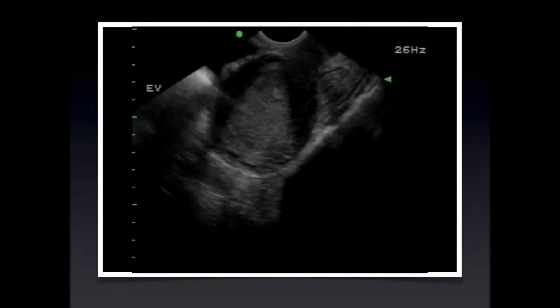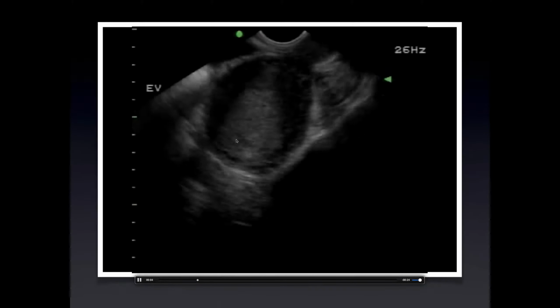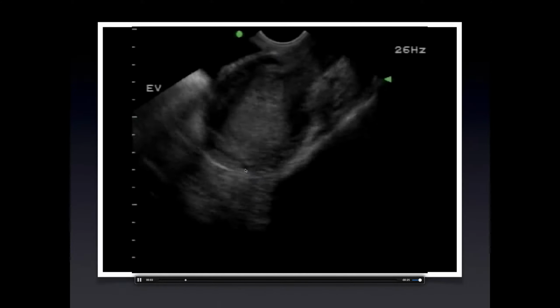Case 10. All right, endovaginal ultrasound, bladder, cervix, anteverted uterus with a fundus. Just switch to coronal plane, scanning up and down, and we're starting to see something over here that looks a little bit suspicious, like that's not what things usually look like. And when we blow it up a little bit, we see something that looks like a gestational sac. We think it's a gestational sac because it contains a fetus, and it has a bright white tubal ring around it, or an echogenic decidual reaction around it.